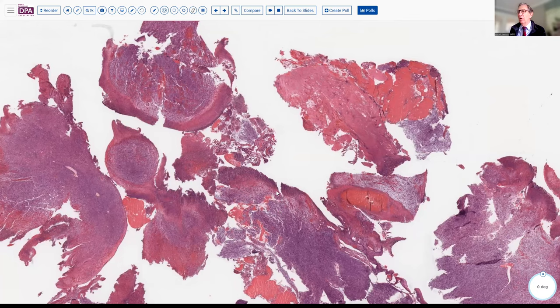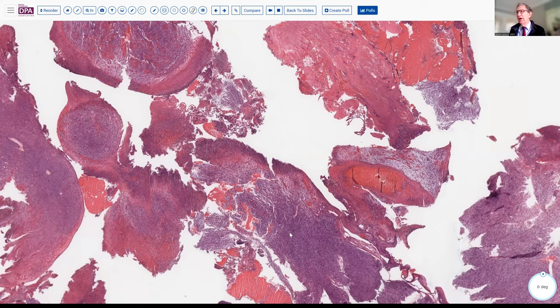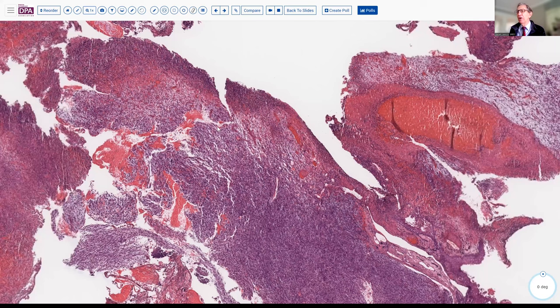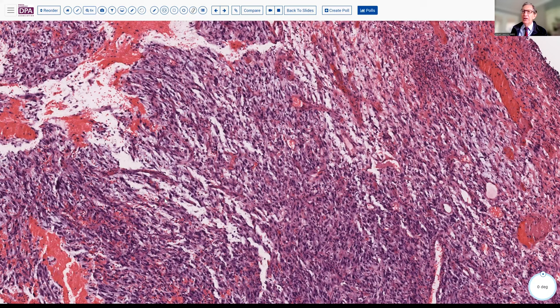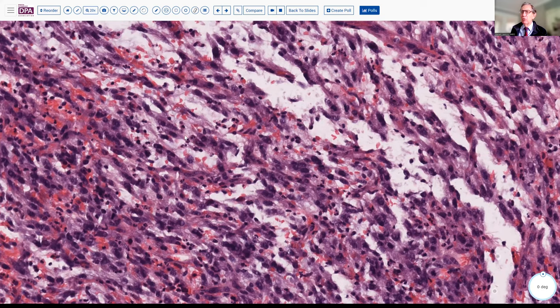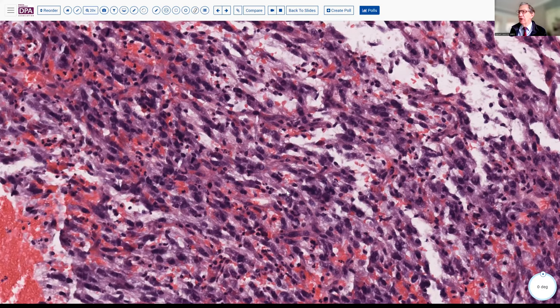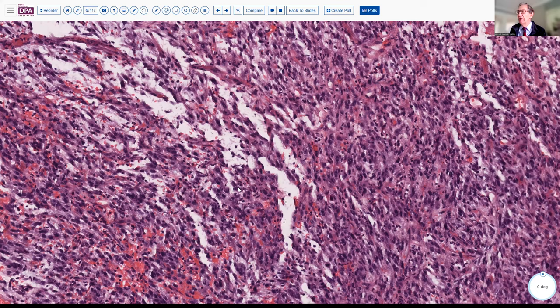At higher magnification, we don't see any defining glandular architecture. We see areas of a vascularized network with some vessels visible. And at higher magnification, you can see there's a degree of spindle-shaped morphology to these cells, but they're somewhat haphazard and associated with a stranding or fascicular pattern in some areas, as well as abundant interstitial hemorrhage.